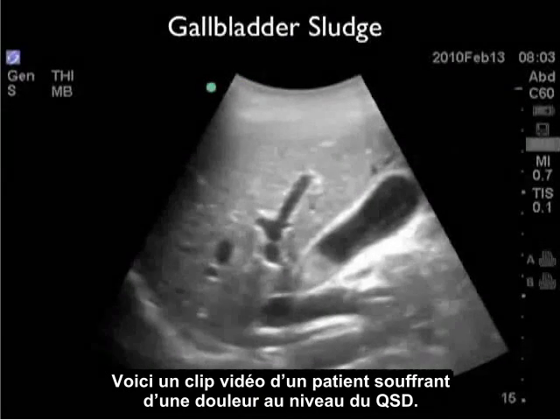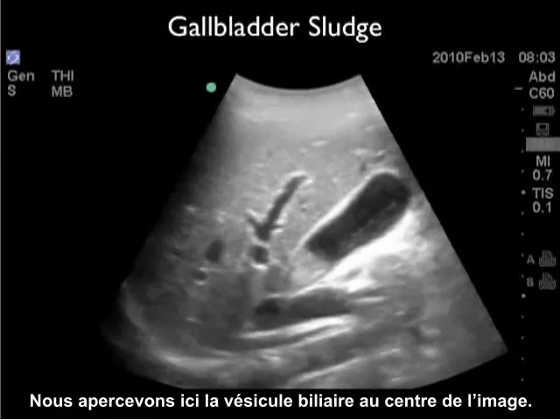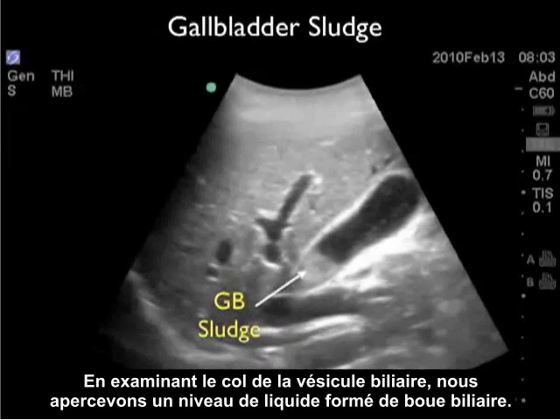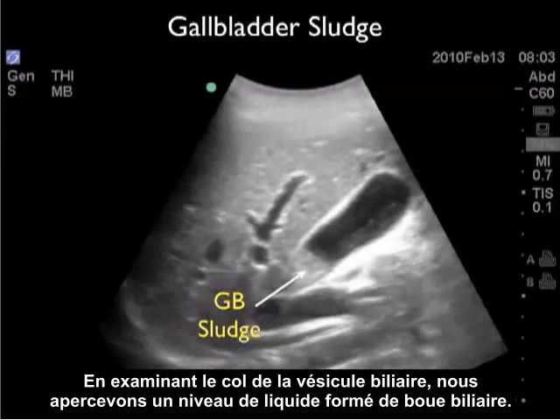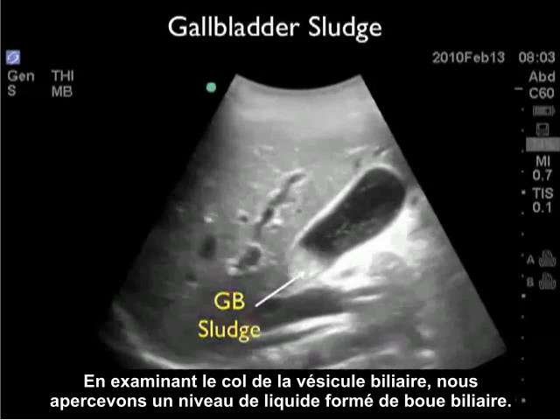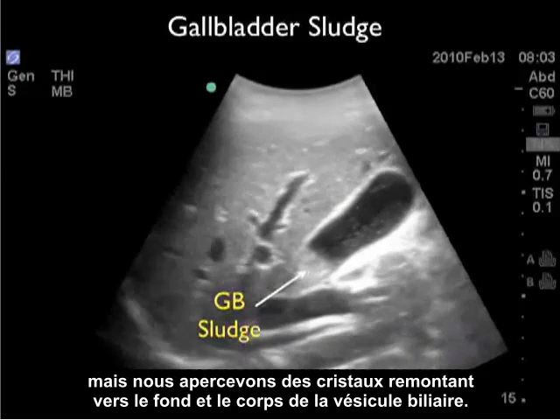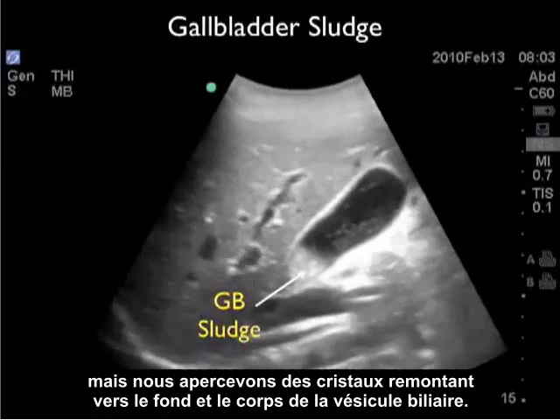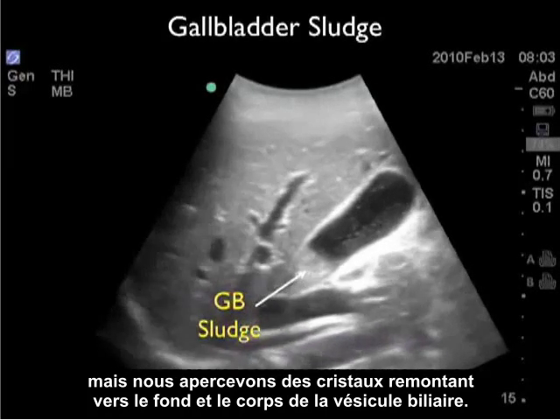Here's a video clip from a patient who presented with right upper quadrant pain. We see here the gallbladder in the middle of the image. Looking towards the neck of the gallbladder, we appreciate a fluid level made up of gallbladder sludge. The sludge is tucked in towards the neck of the gallbladder, but we see crystals moving up towards the fundus and body of the gallbladder.